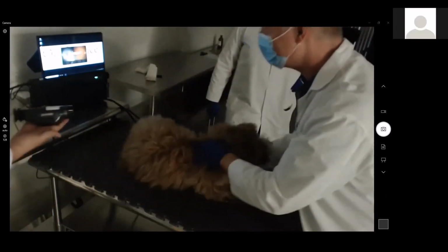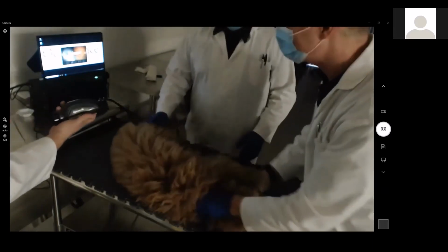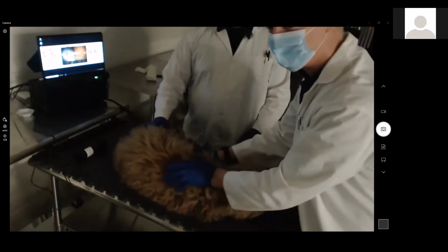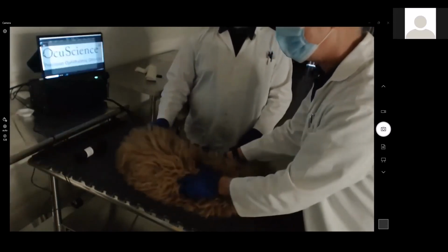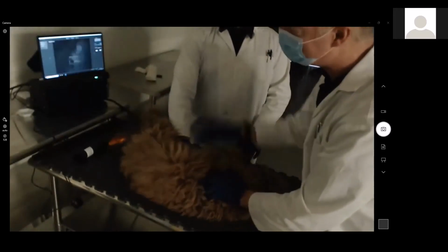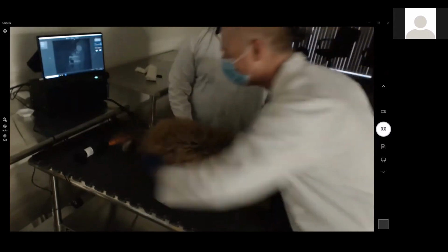But I just wanted to bring that to consideration here, since we're talking about fundoscopy and everything else. Our small fundoscope works really well on the really small animals, but for fundoscopy in the clinic environment, you need to have something that works better for the larger animals. So that's why I brought this one along, just to make the case in point.